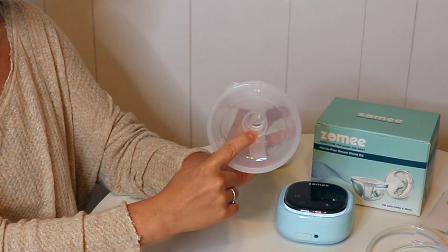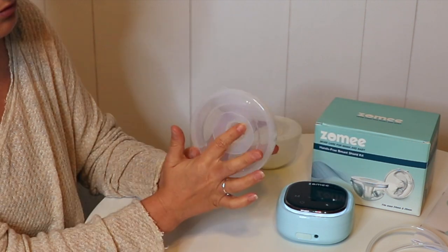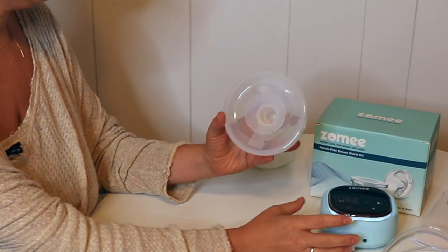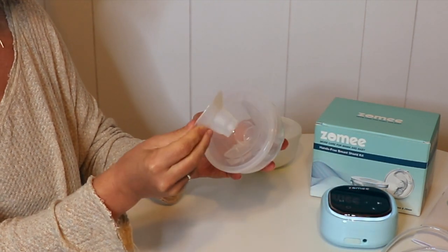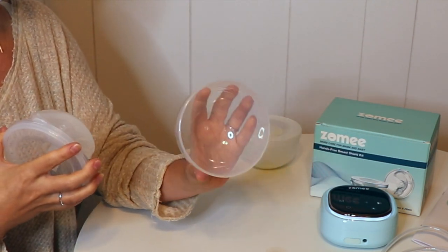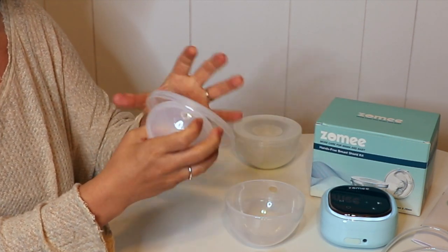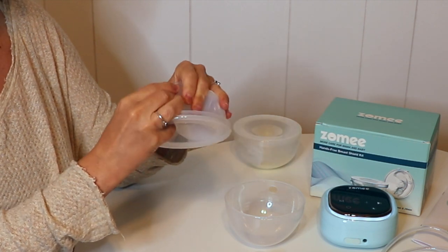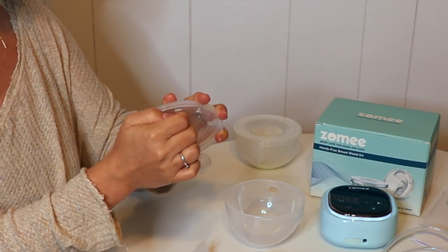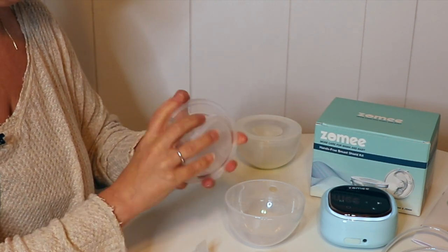The size flange that it comes with is a 28 millimeter, and it comes with a 24 millimeter insert that you can put in there for a smaller size. So I'm going to take this apart and show you all the pieces. We have the insert, we have the flange, and this is the collection cup with a pouring spout at the top. We have a duckbill — so again a duckbill system — and we have a diaphragm up here which is removable.